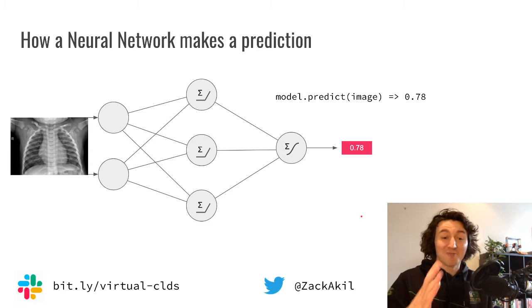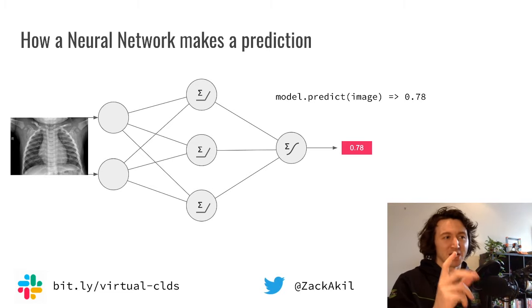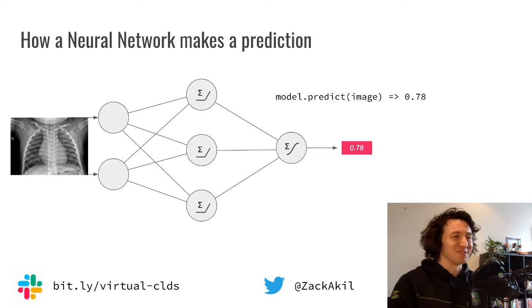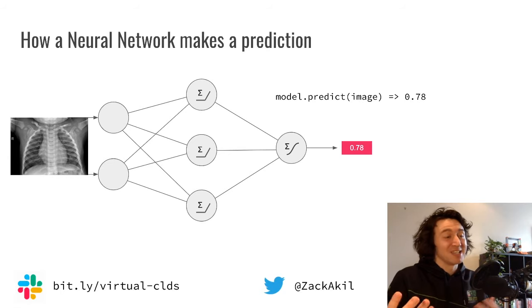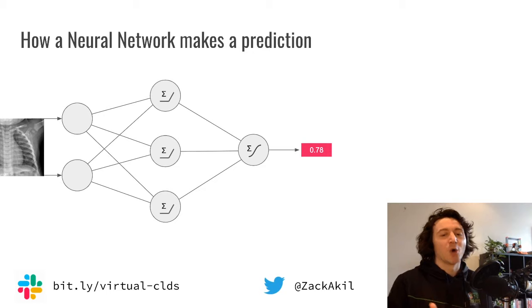Everyone was correct in thinking that it would predict one, but actually, in a neural network, the output would be a continuous number. It wouldn't be a strong 1 or 0. It was a trick question. The output would be something like this, which you'd be completely right in interpreting as a 1 or a 0. Because naturally, if someone said, "Is this a 1 or a 0?" you'd say, "It's closer to 1, so we assume 1." That is exactly how we then interpret it.